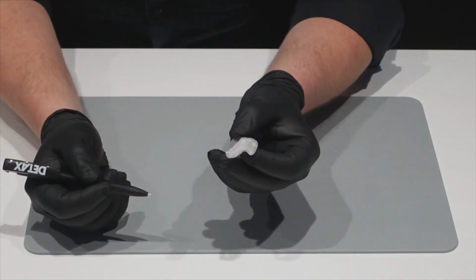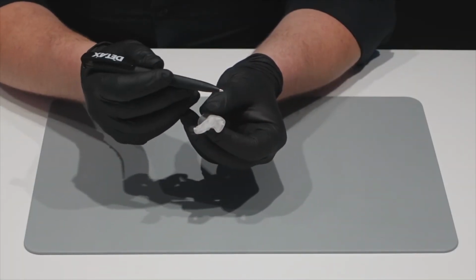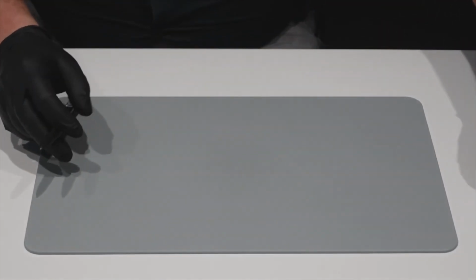Why do you need the spurs? If you fill it up with silicone and there's only a hole and you take it later in the pressure box, the silicone will go inside and the rest of the air will go outside. And then you have a small area without silicone, and then it's also not usable. The mold is later not usable. So that means inside of the spur is the rest of the silicone. You take it to the pressure box and it goes a little bit inside of the spur, but your mold later is complete. That's the reason why.